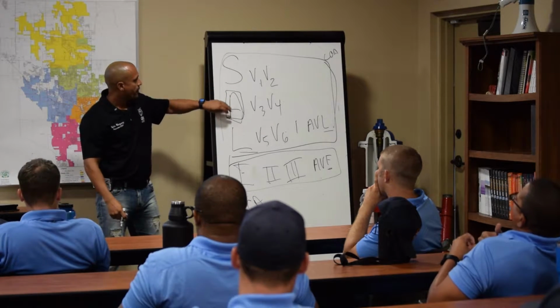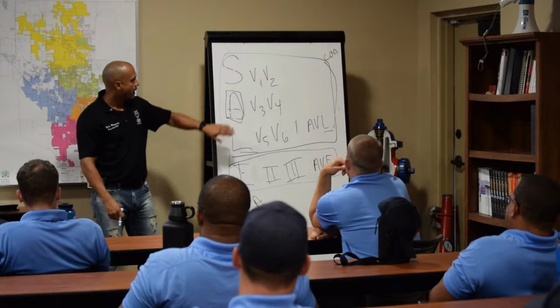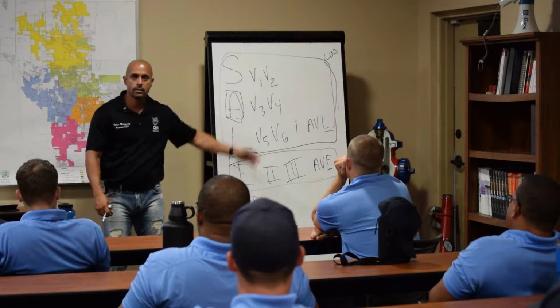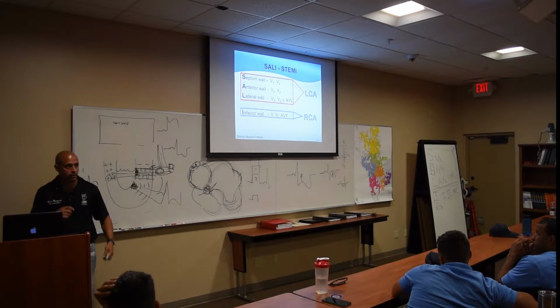Okay. So if I have V1 through V4, what kind of MI is that? An anterior septal wall. If I have anterior lateral involved, we'll call it anterior lateral wall. And those are the easy ways to remember ST segment. Everybody good with that? How many leads we need to call it MI? 2.